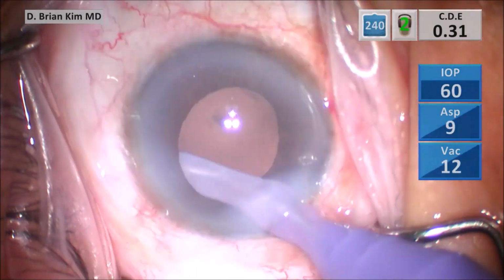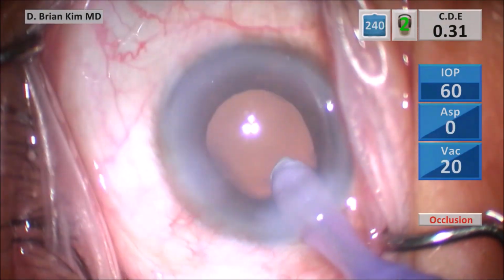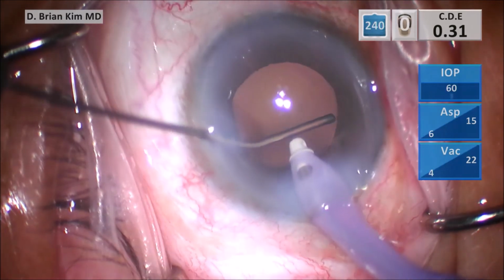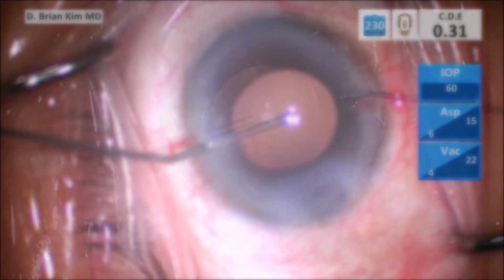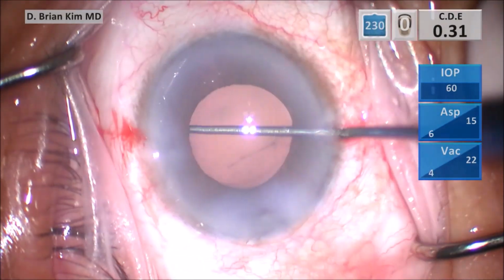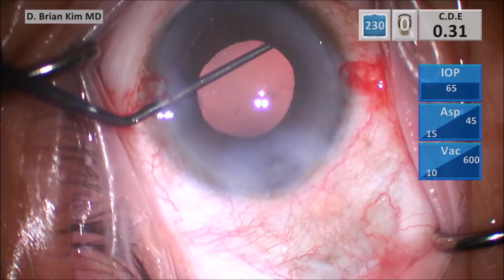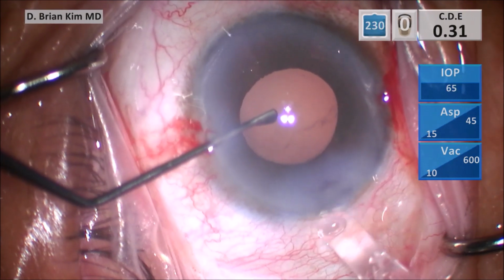And the polish mode really provides excellent safety, being able to place that tip out even though I can't visualize it. I'm pushing BSS through my paracentesis. I'm pulsing BSS into the subincisional capsular fornix to look for any dust bunnies. I inject some cohesive viscoelastic, and then I sweep to the left side and then to the right side. Again, I'm trying to smoothen out and remove any potential lens epithelial cells. These lens epithelial cells can cause capsule contraction over time. And so I'm sweeping first to the left and then to the right.